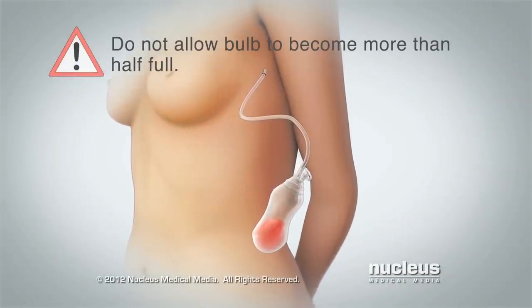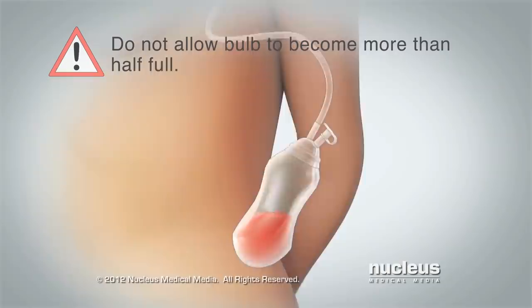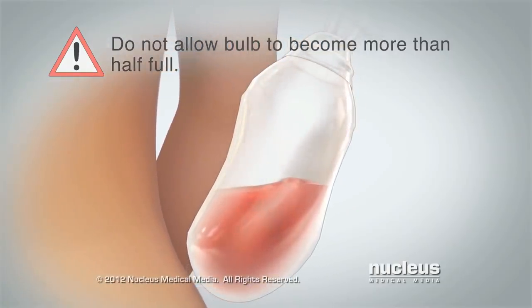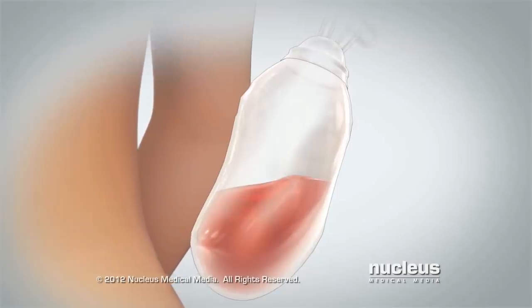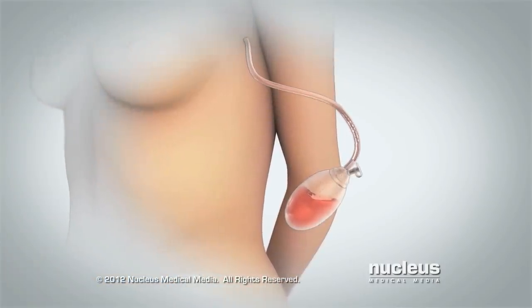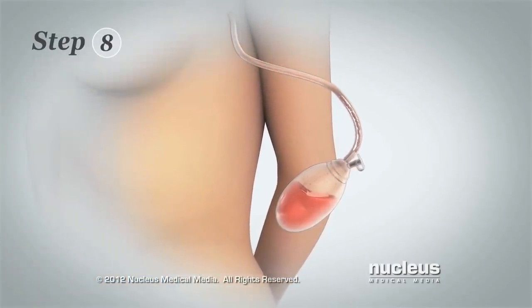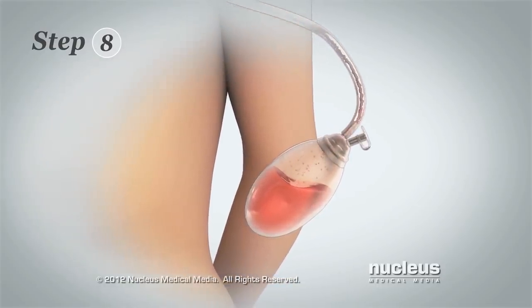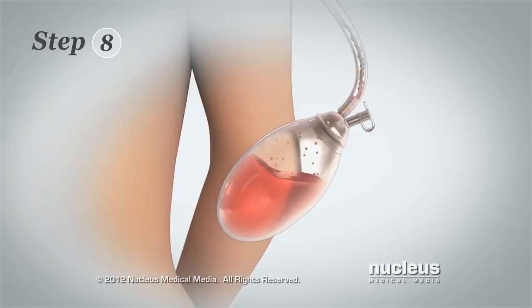Do not allow the bulb to become more than half full. Too much fluid in the bulb reduces its ability to remove fluid from underneath your skin. Now you will begin emptying the bulb. Step 8: Hold the bulb lower than your incision so that fluid moves out of the tube and into the bulb.